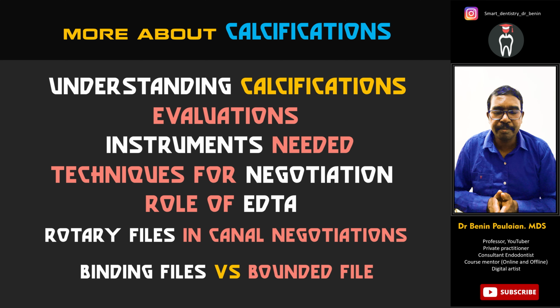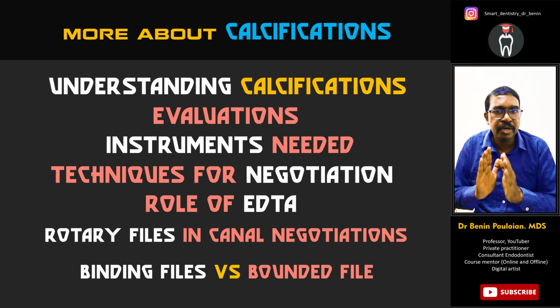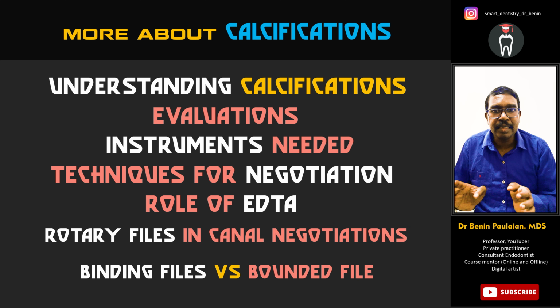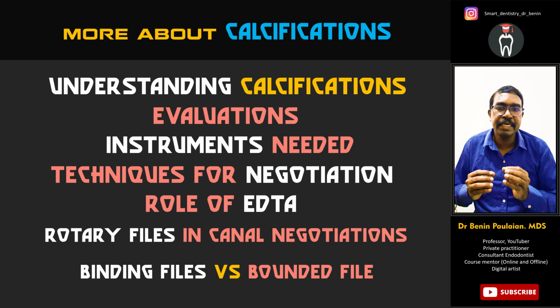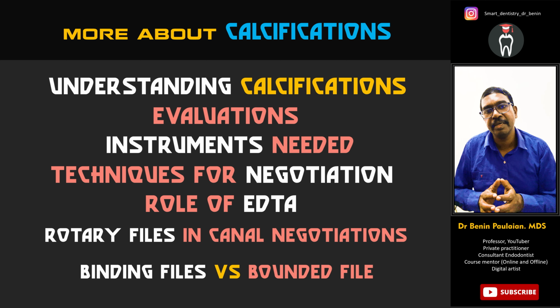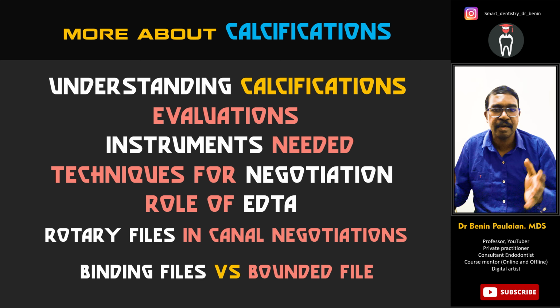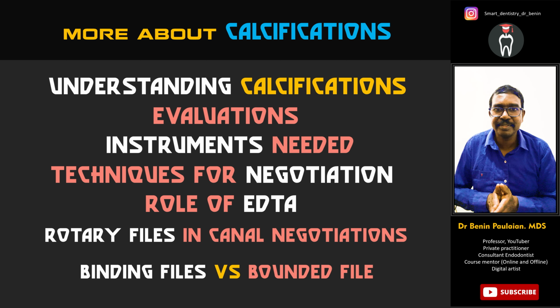At this stage, I want to make sure that if the canals are completely calcified, meaning 100% calcified, which is unlikely, then canal negotiation may be difficult, or in some situations it may be impossible. Trust me, most of the calcified canal negotiation cases you see on social media are only the successful cases and not every case. Hopefully you understand what I am trying to say.